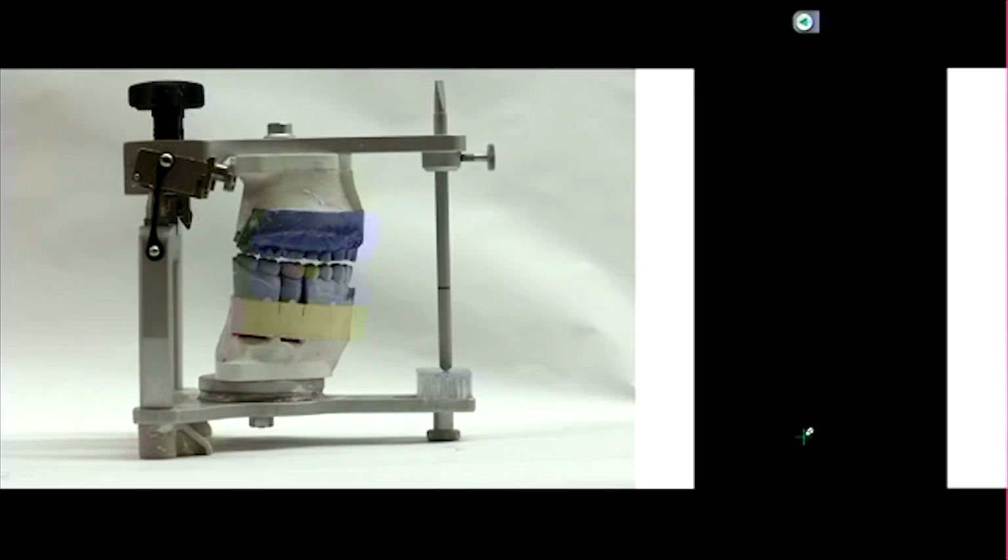Okay, so let's paint this example. Let's say a patient came in and looked like this, so all the teeth in their mouth. Okay, let's say they had tetracycline staining, and they just want new crowns, and they want just white teeth. Okay, so you go ahead and you prep all the teeth. I just kind of ground the stone there. Okay, so now we've prepared it for crowns.